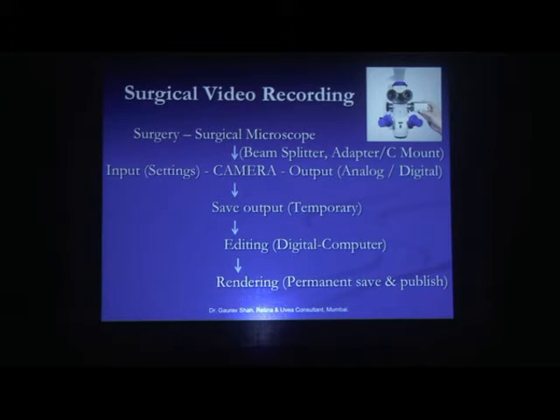Whatever signal is coming out, that is essentially the surgical video, we need to save those videos, and this is a raw file, that means unedited. Your whole surgery most of the times you will be recording. You need to store these various files for future.